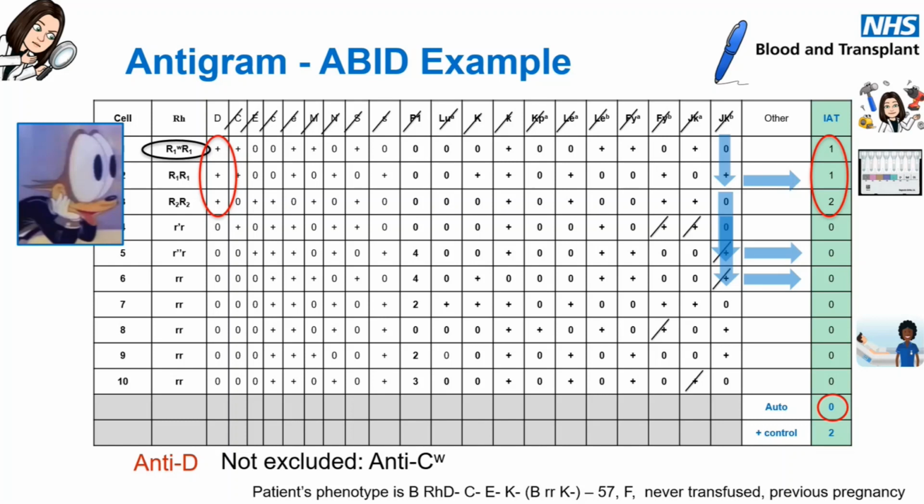So I hope that makes sense, but you could always contact your local reference lab and ask what they do, but it depends on the patient. If we've seen them previously and we know that they're going to be pan-reactive by automation, there would be no point replicating that because you want to conserve your plasma. It's a limited resource and you don't want to have to re-bleed someone just because you've used a technique that you don't necessarily need to.